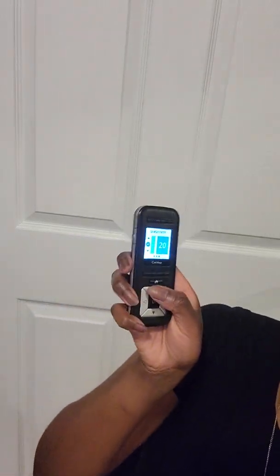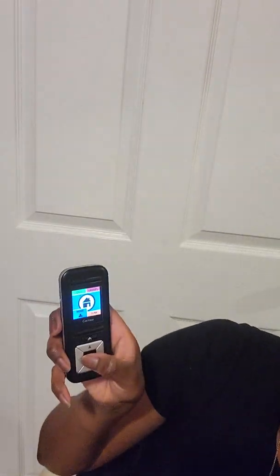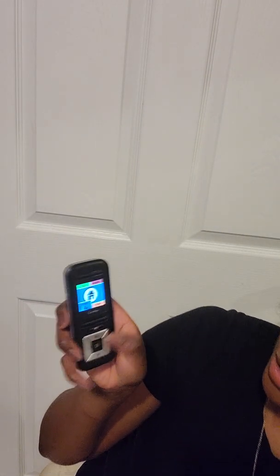You would just go all the way up so you can hear it a lot more closely. Or if you want it further, you just turn it down some. So I'm just adjusting back to where I was. Yeah, that's my remote. That's how that works. It's hooked up to my device, my microphone, and I can just adjust it whenever I would like. So it's really cool, pretty cool.